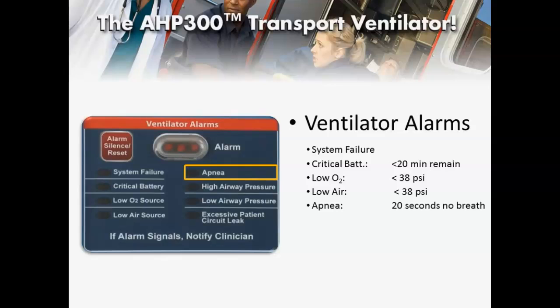This mode is a fixed, pressure-controlled ventilation mode that operates at 20 centimeters of water and 10 breaths per minute. Note that the control lock also activates when apnea backup ventilation is triggered. The alarm will clear if the patient takes 2 spontaneous breaths within a minute. Also, if the clinician deactivates the control lock and changes the ventilator to controlled mode, the alarm will clear.